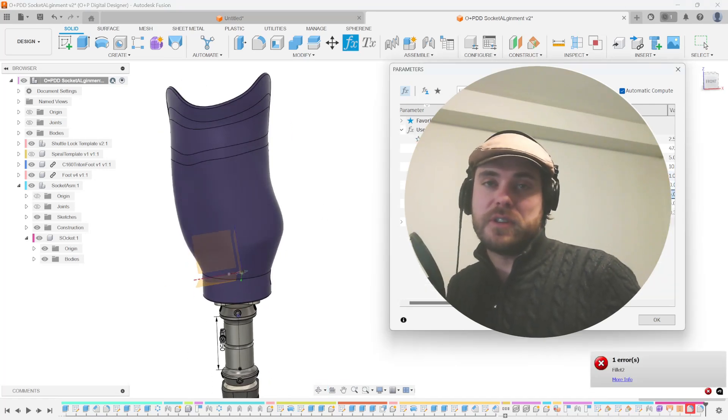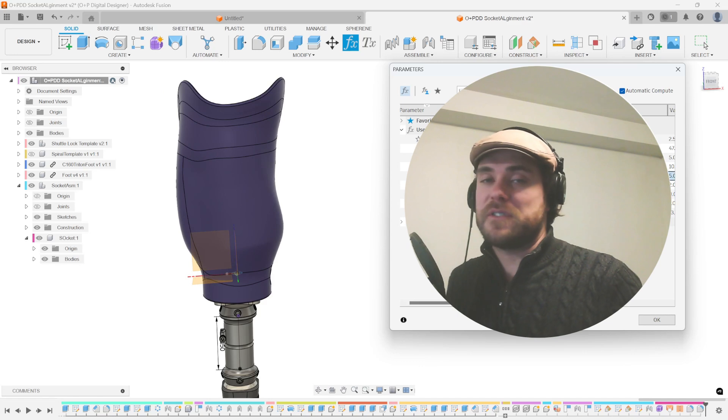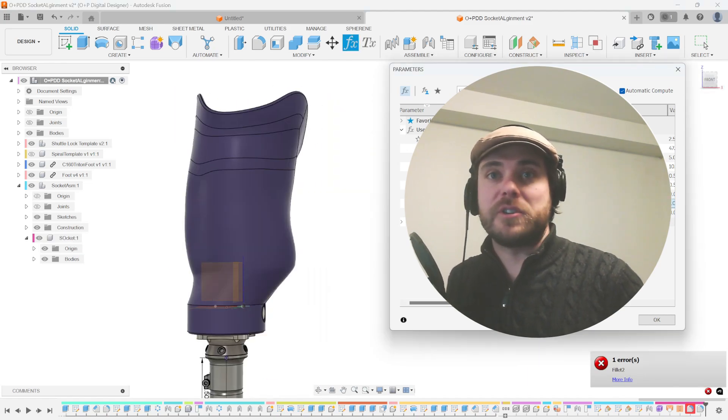Did you guys know that you can now do alignments within Fusion 360? It turns out you could always do this, and I've just figured out a way to do it so that you can have absolute control for each alignment without losing your work. Check it out!